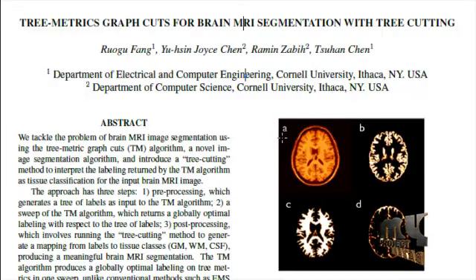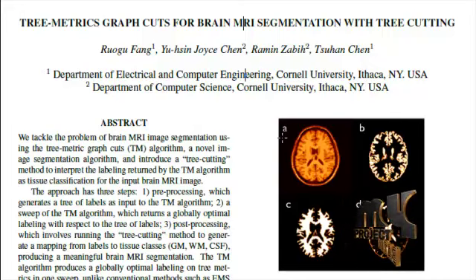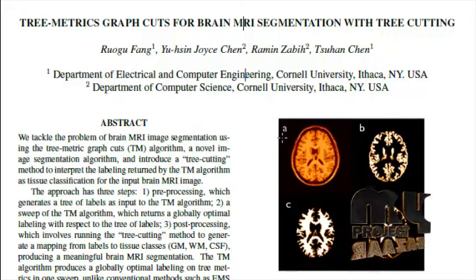Let's discuss the project about tree metric graph cuts for brain MRI segmentation with tree cutting. We present a novel approach to apply graph cuts algorithm with tree metrics using pruning to the medical image segmentation problem and compare our result with the state-of-the-art methods.